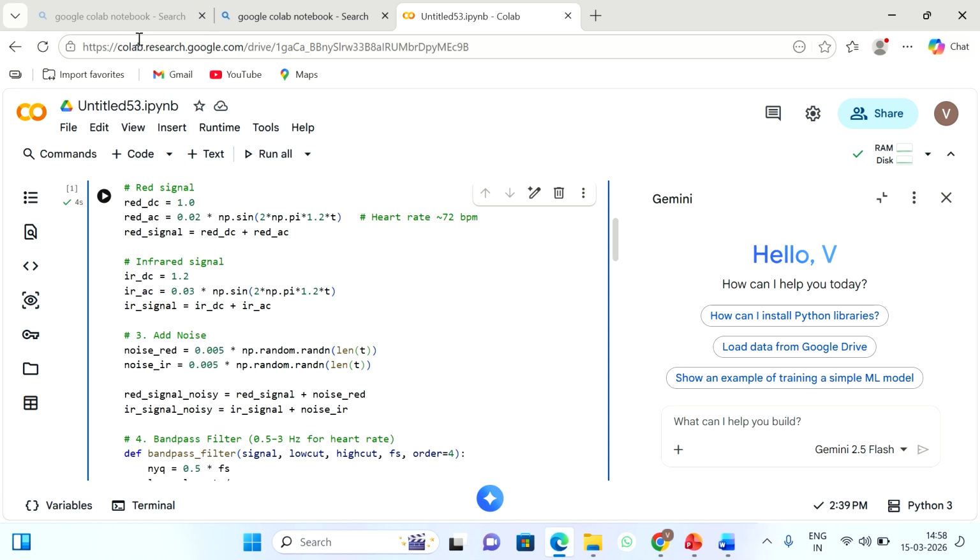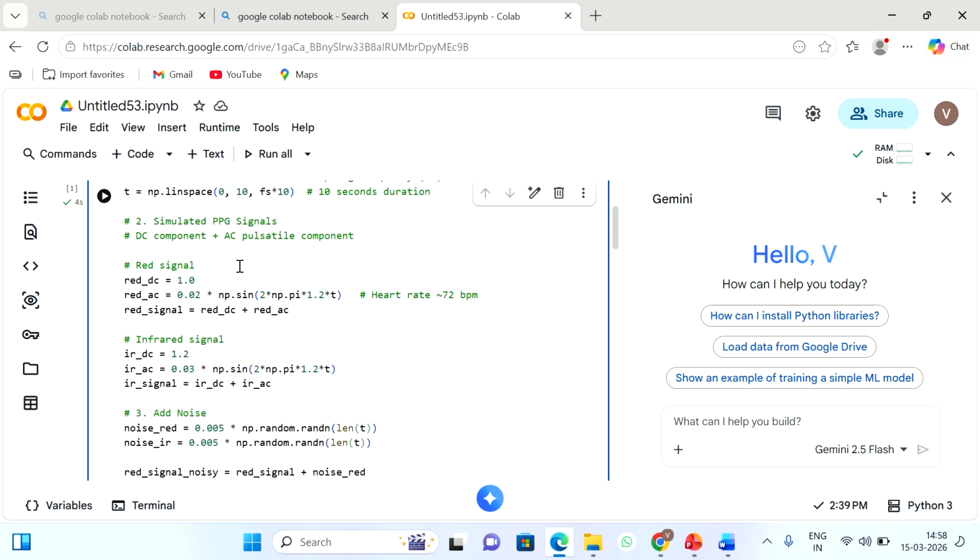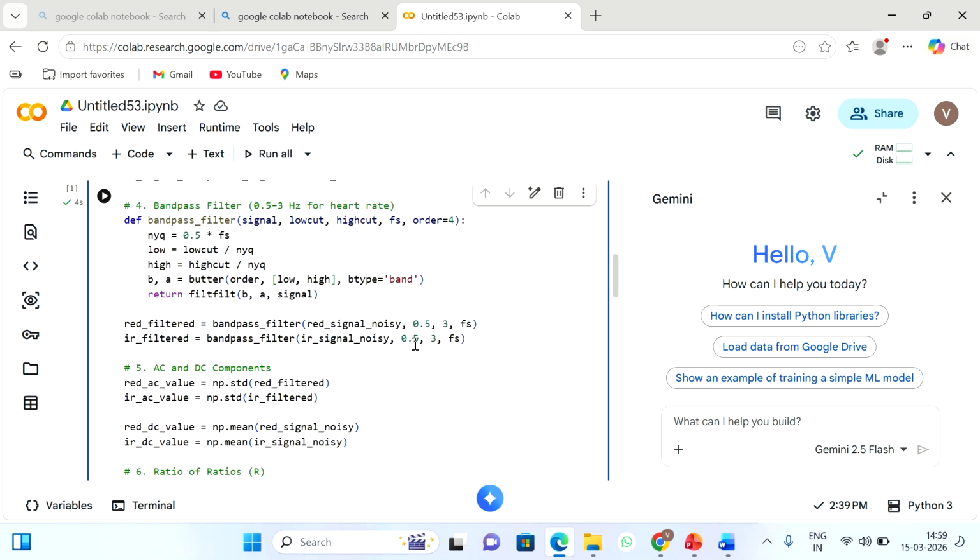And then we have to define the band pass filter with the signal. So we know the signal and then low cut. We will determine the low cut and the high cut, and then the sampling frequency. Already we know fs is equal to 100, and then order is equal to 4. So for all BMI signals we are taking order as equal to 4, because if the order of the filter is higher, then the filter will be steep and very smooth filtering will happen. Orders 1, 2 and 3 are normal, and beyond that, 4th order means still we will get smooth filtering. That is why a higher order filter is applicable here.